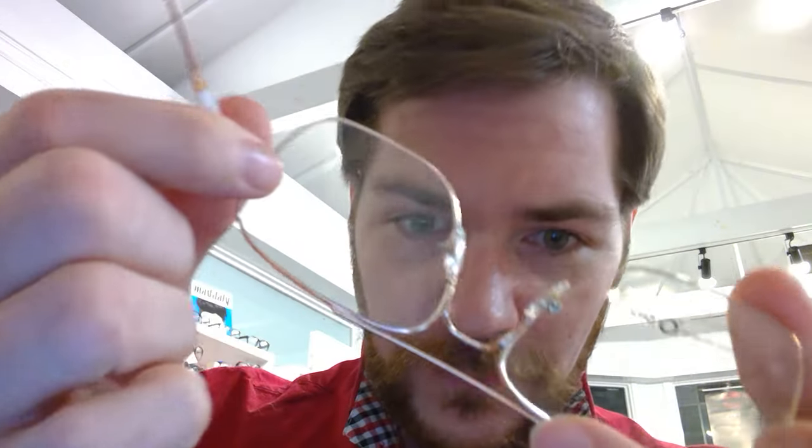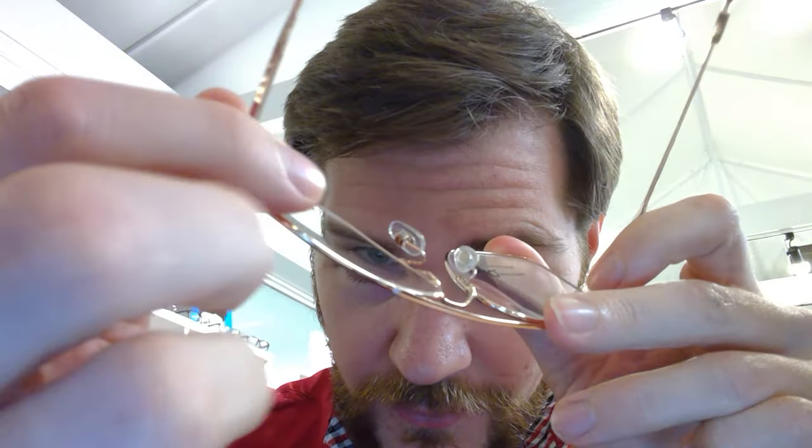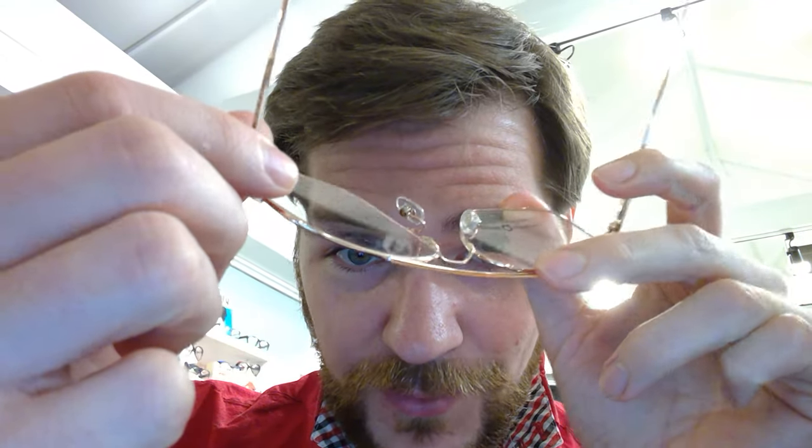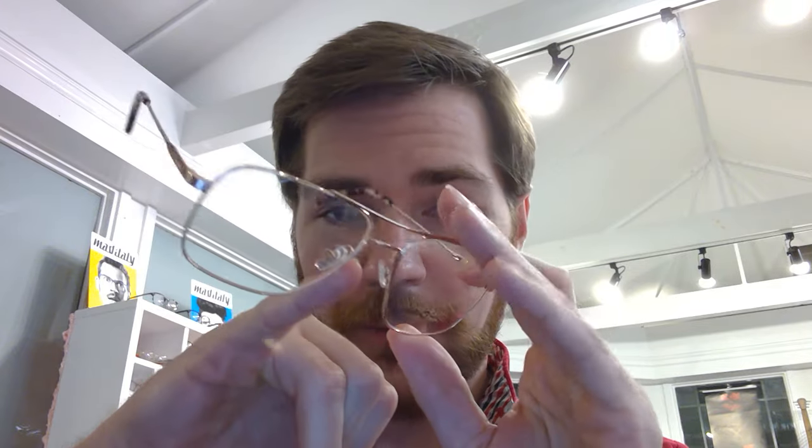We're gonna zoom in so you can see that little connection point - the little metal arm is the pad arm, and then the nose pads themselves right here. Now there are a lot of different ways you can adjust those. You can use your fingers but I don't recommend it, because that puts a lot of pressure on the solder joint and those can pop right off. Especially if you're out and can't see without them and don't have backup pairs - don't do it.